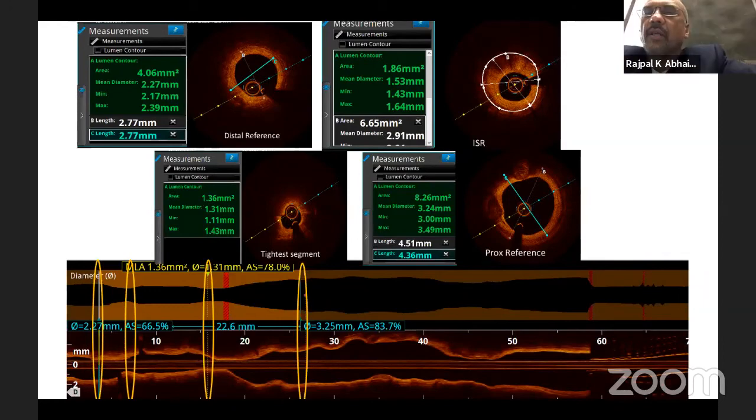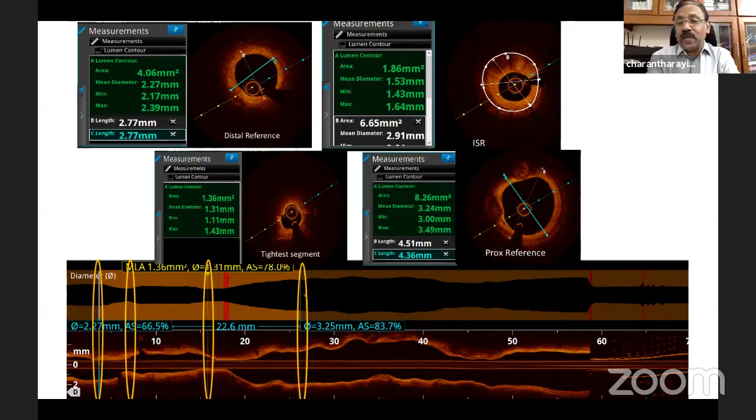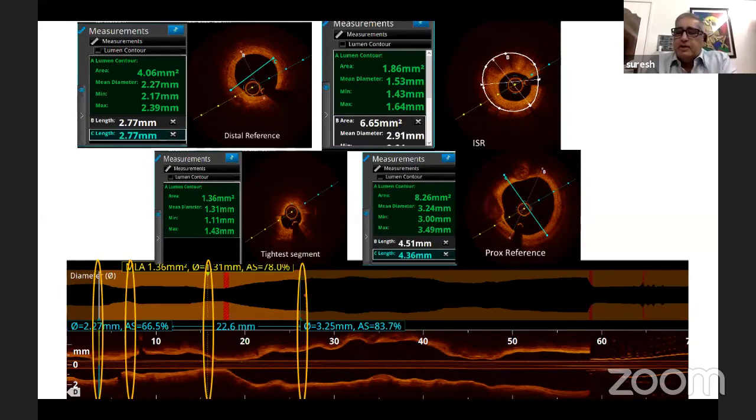Okay, absolutely. Fair enough. I see that you really needed a little longer stent. Yeah, because of the way the material was, the balloon would ping down, ping up. So we were going to create internal damage on both sides of the stent. So we said we might as well cover the whole area without having to worry about any other.